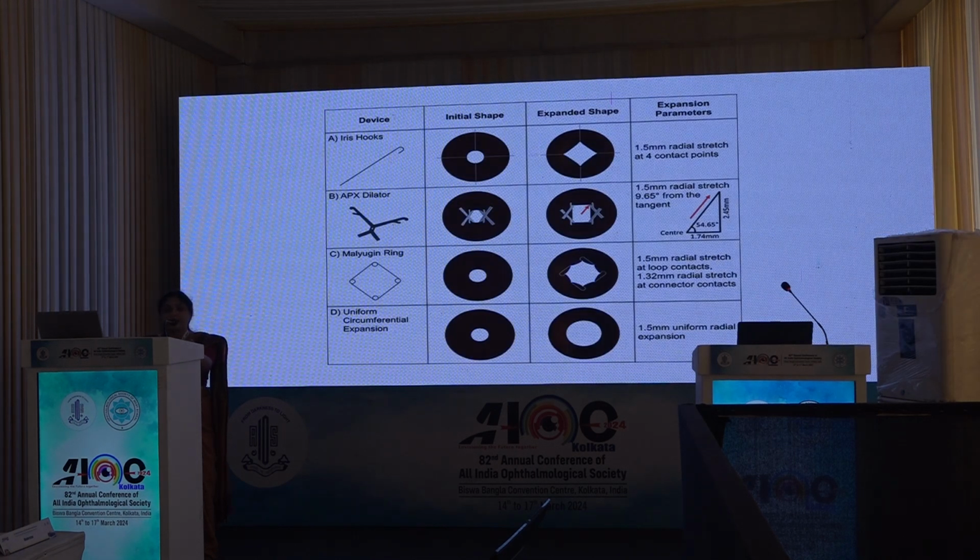So what are the other devices? We can use an iris hook, a dilator, or a Malyugin ring. These are the two commonest things, iris hooks and a Malyugin ring. But then they increase the surgical time.